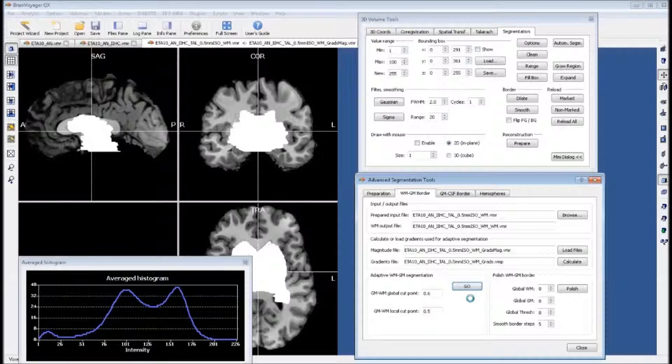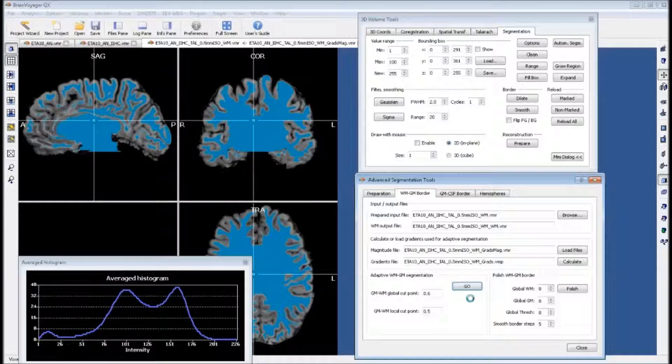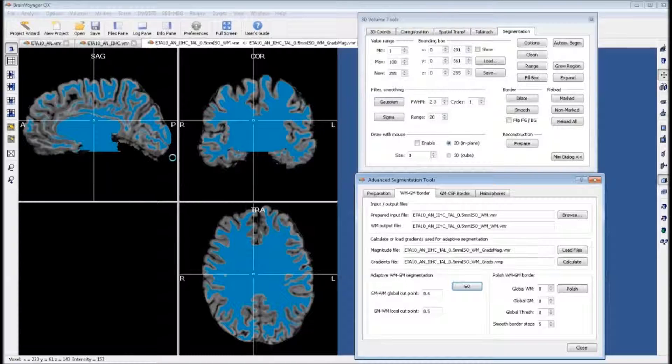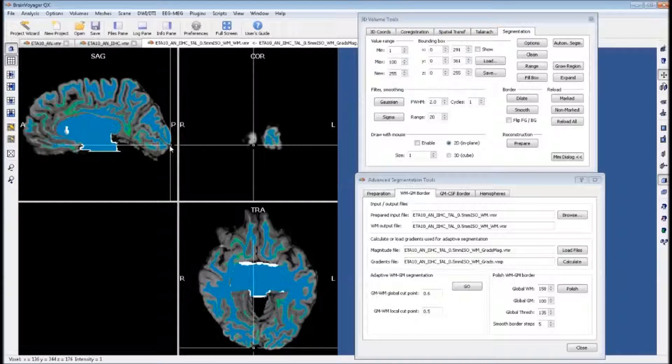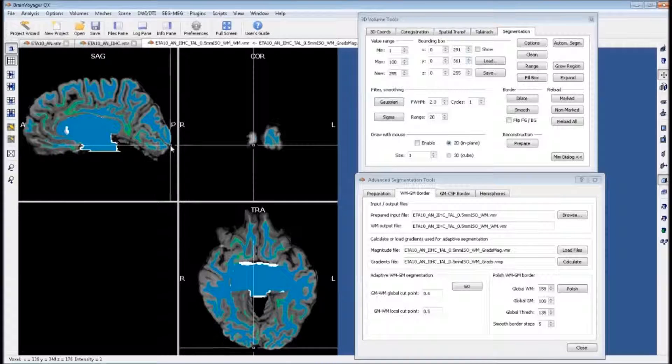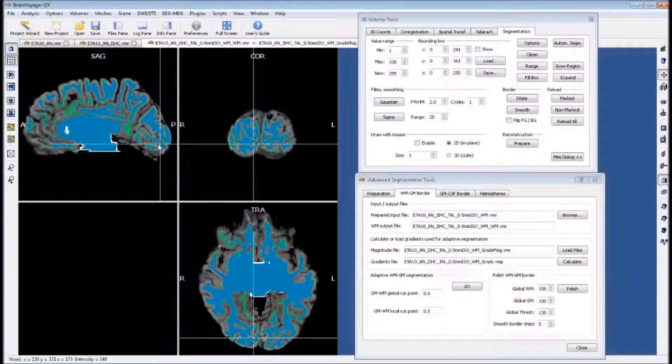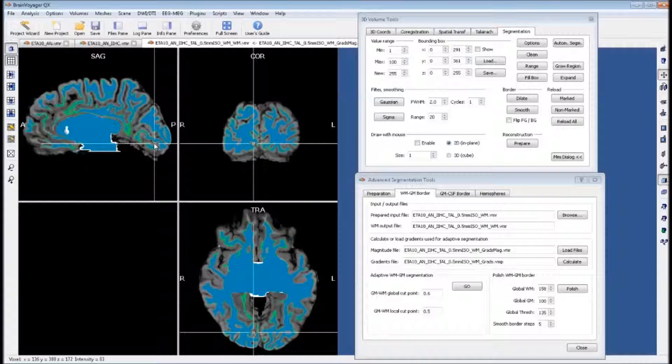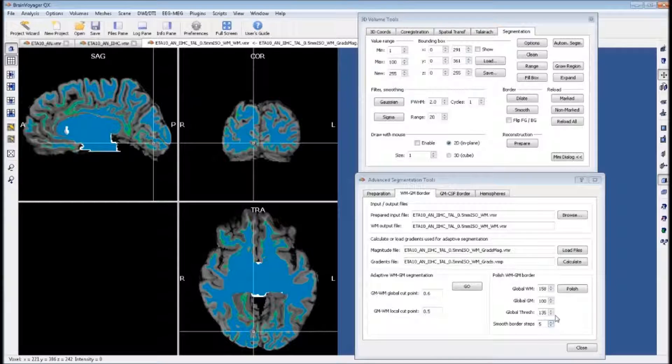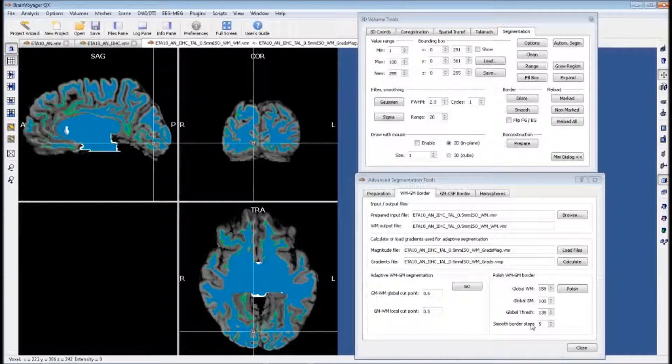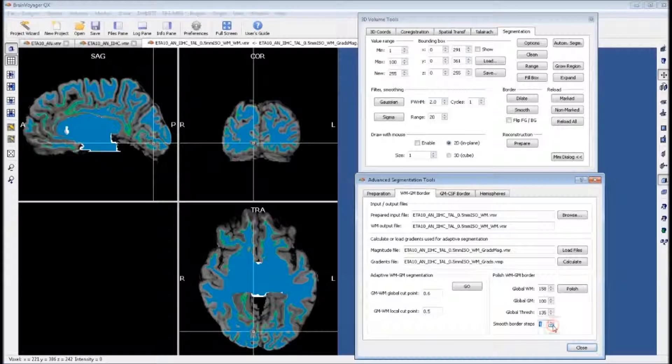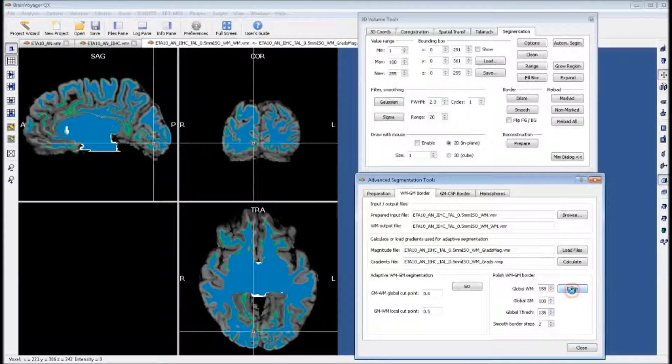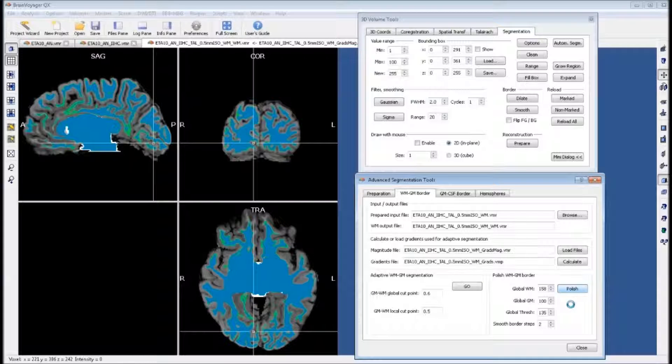If you find that it colors in the gray matter too much, you can adjust these values. We want to check that it's not colored in the gray matter too much. This looks pretty good. Now we want to polish this, incorporating the green boundaries into the blue coloring. For this, we want to change the number of smooth border steps to two and click polish.